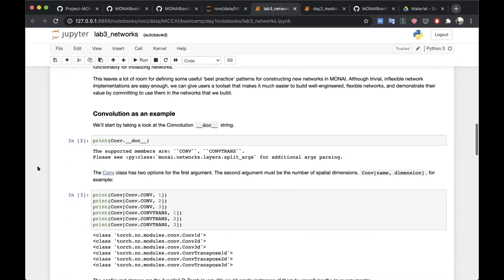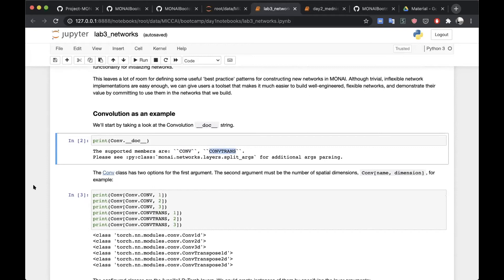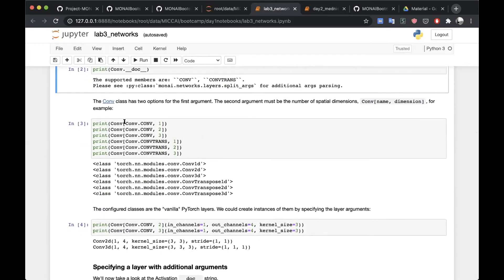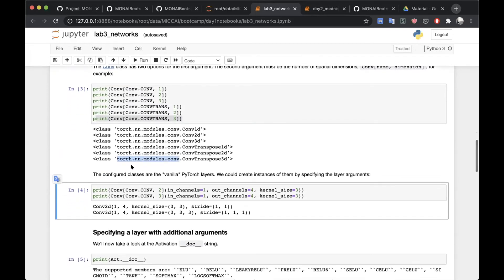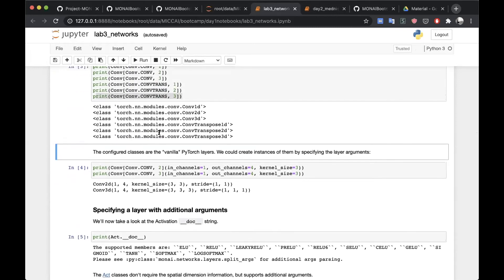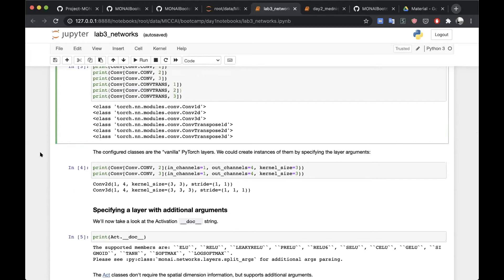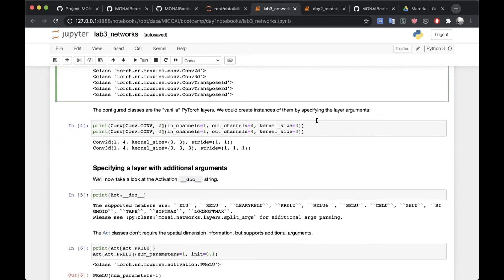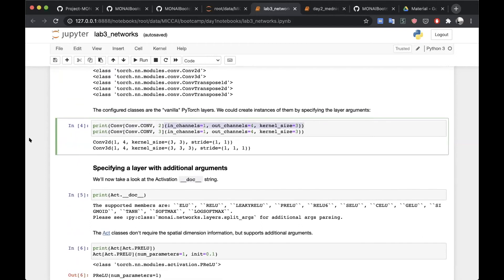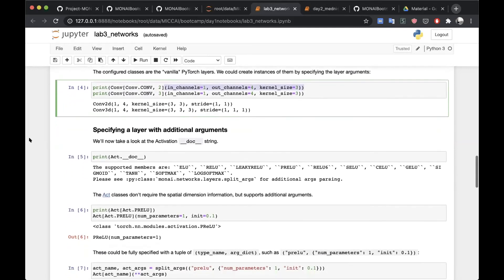We start by looking at the convolution layer. If we print the docs, we can see that we can either have a convolution or the transpose of the convolution. It takes two arguments: is it either the convolution or the transpose, and how many dimensions is it? When you print that, you can see that all it's doing is returning the PyTorch convolution class. This gives us a nice way of accessing those PyTorch classes programmatically.